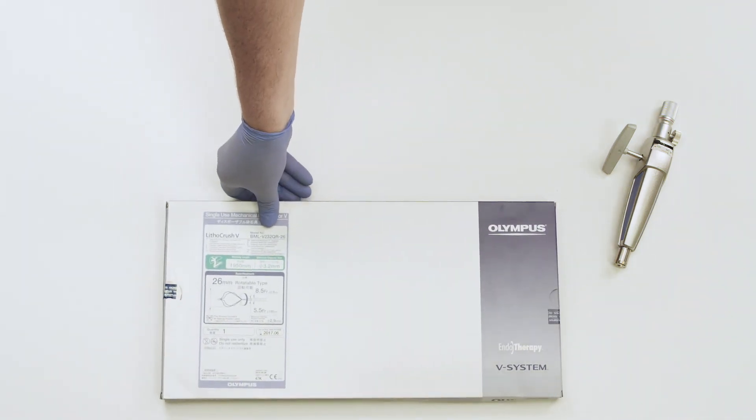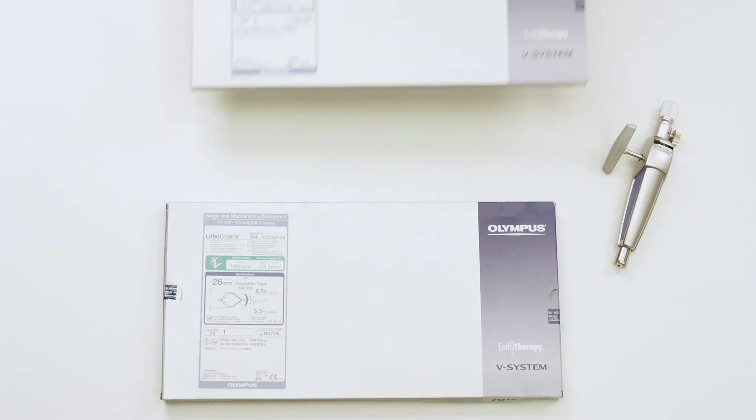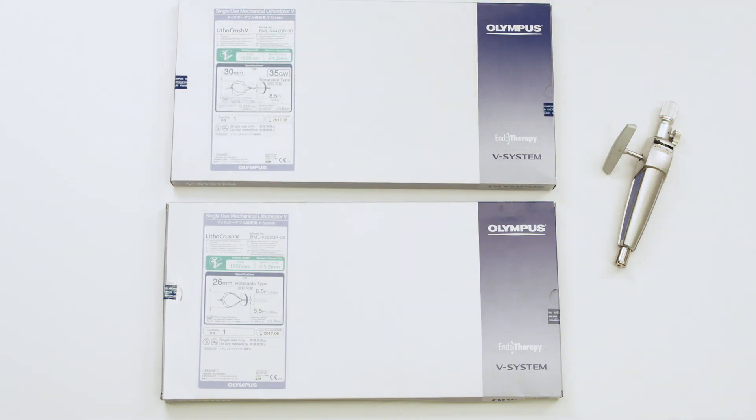Let's review the assembly of the Lithicrush V Mechanical Lithotrypter. There are two different versions of the Lithicrush V. One is the rotatable bullet tip version. The other is the distally wire guided version. Today, we will review the distally wire guided version.